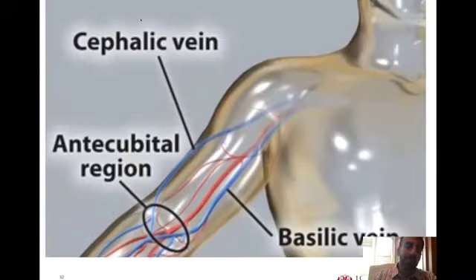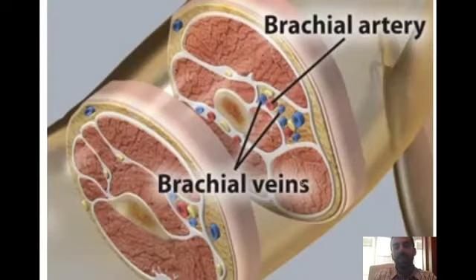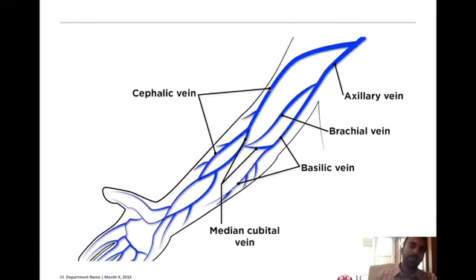So the three veins that we were talking about are the cephalic, basilic, and brachial veins. Those are the areas that we'll talk about. This cartoon just breaks down the venous structures themselves. The cephalic runs up on the anterior aspect of the arm if you're looking at this pronated position, and it is very superficial, although still hard to visualize in some patients, and so ultrasound can be very useful to identify that path. As we work more medially, we'll come across the brachial vein, which will be along the brachial artery, and we'll show you a slide on this.